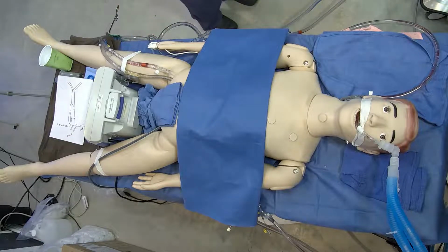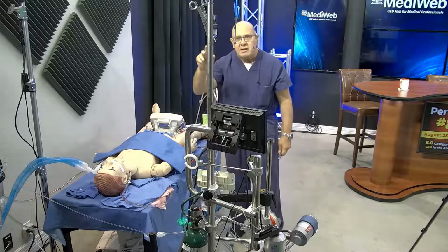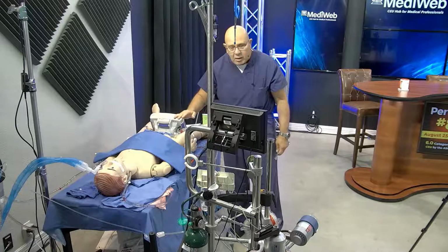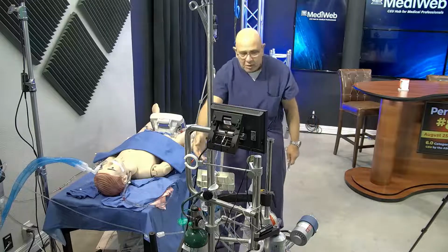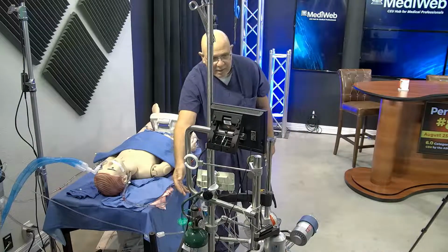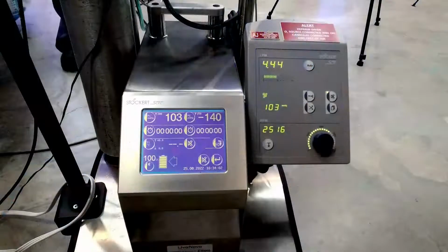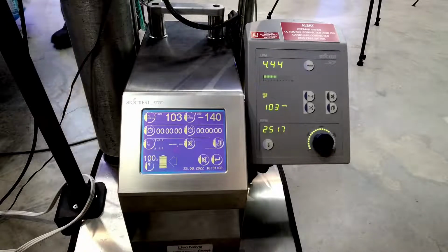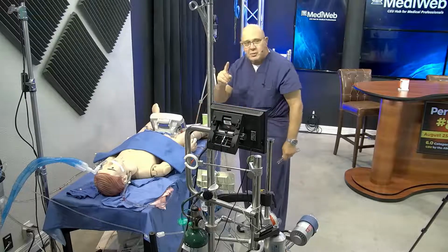Now, where this becomes a real challenge, so let's go to camera 4 and I can talk to the folks. Hey Austin, where this becomes a real challenge is in what are our flows? Well, we have a total flow. So what's our total flow? Go back to our multi-pack or to the ECMO simulator. Yeah. Our total flow is 4.4. But how is that being divvied up? That's really the question. So what do we do?